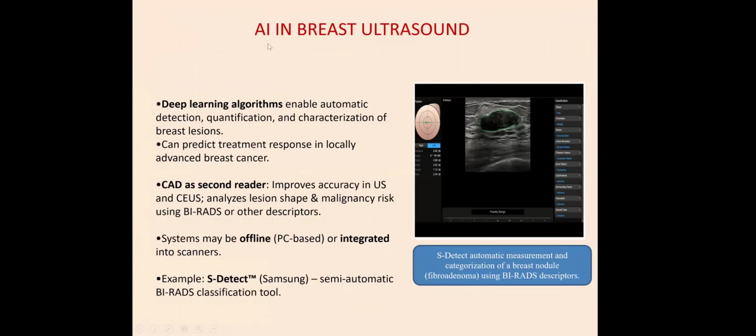Now, AI in breast ultrasound. AI has been used in all imaging from head to toe, and it is also being used in breast ultrasound. As you know, the basic fundamental about AI is that it uses deep learning algorithms, which enable automatic detection, quantification, and characterization of breast lesions. It is also used to predict treatment response in locally advanced breast cancer.